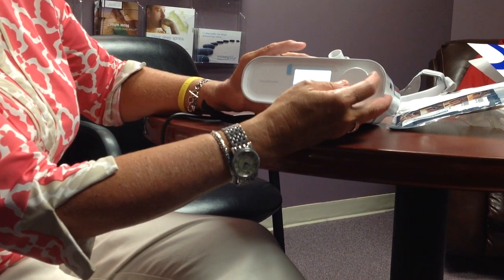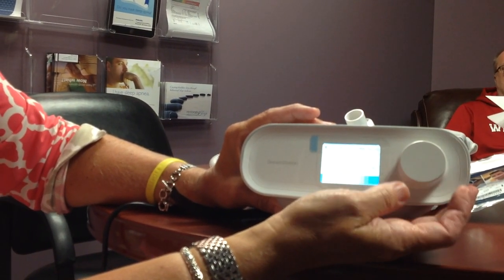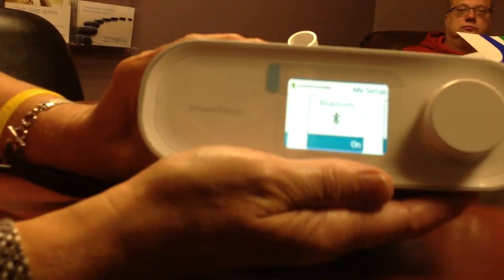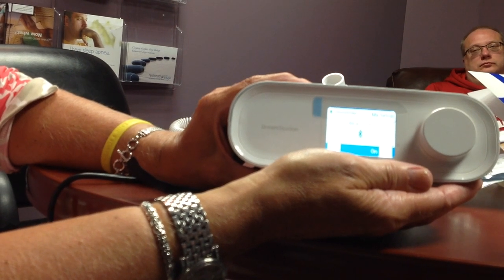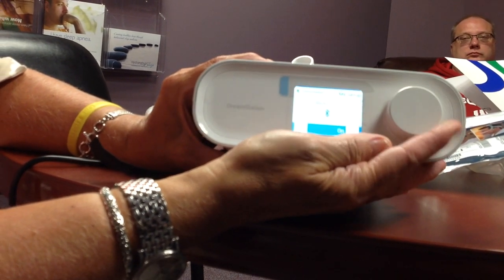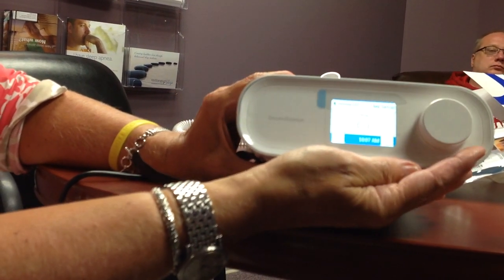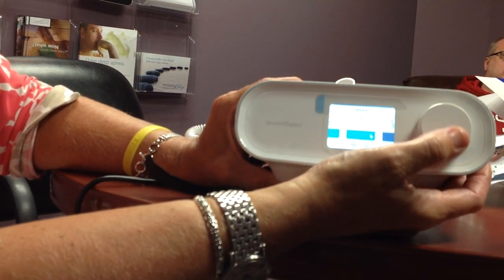Back in the rest of your setup, the last one is showing your modem — it's saying it's on and has bars showing you're good. The Bluetooth is on to enable you to put your Dream Mapper onto your smartphone. You are able to see your information in three places: your computer, your cell phone, and on the machine. This also shows the time, which will change for daylight savings time if that is in your state, and should change when you move from state to state.